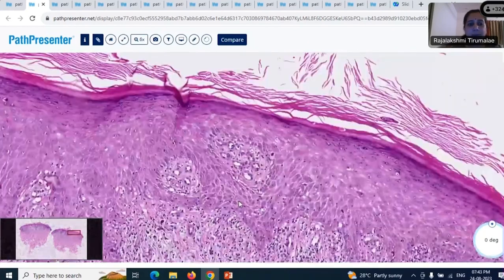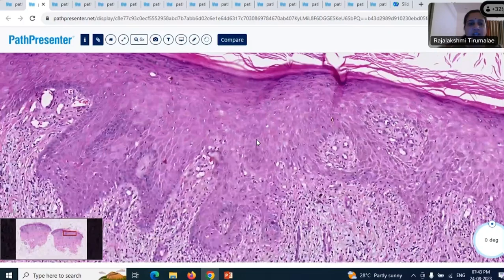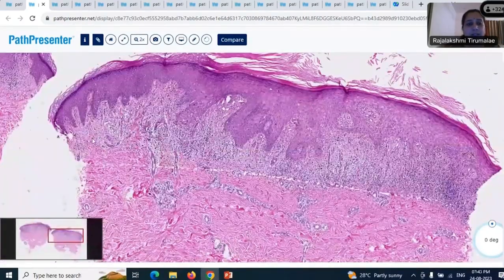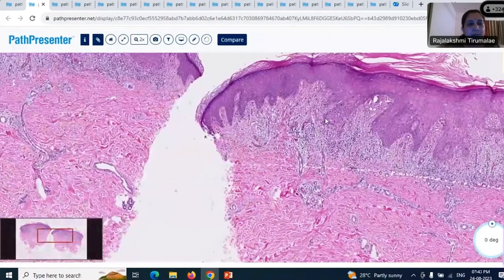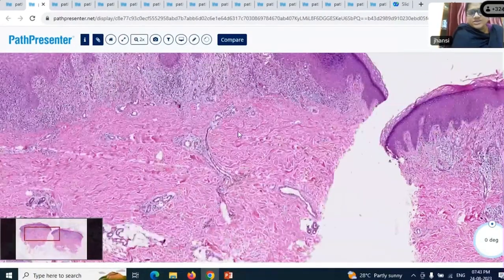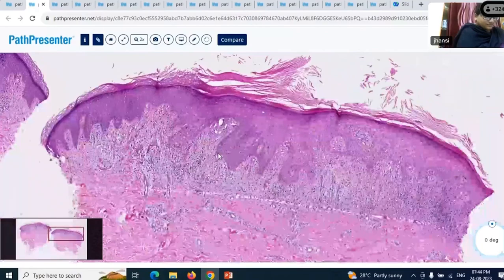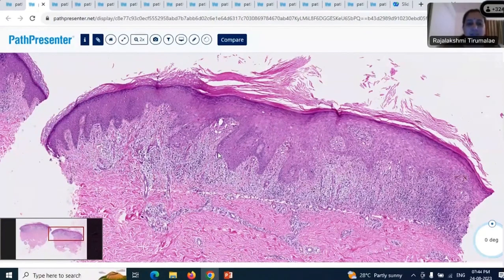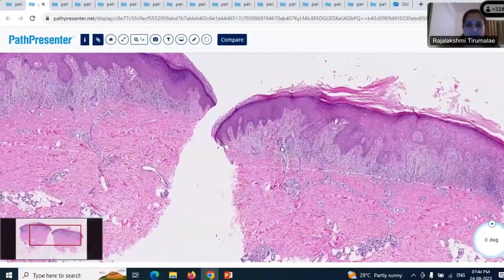Other than that, you have basal vacuolar alteration, necrotic keratinocytes, and this band-like infiltrate. What is helpful is not just the wedge-shaped hypergranulosis you described. What is the shape of the acanthosis that you're seeing? Can it be likened to something? Sawtooth, yes. Sawtooth-like or irregular acanthosis, right? So what is the diagnosis? I think that's pretty straightforward. Lichen planus. So this is a case of lichen planus, right?